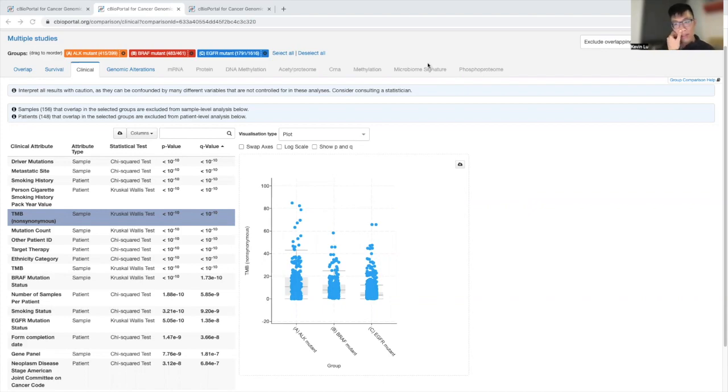Today we're going to focus on how to make and compare multiple groups. In our last video, we demonstrated how to compare between two groups. The example was comparing within one gene, so patients who had a TP53 mutation or did not. That was the comparison from last video. In this video, we want to answer the question: how do we compare patients with different mutations?